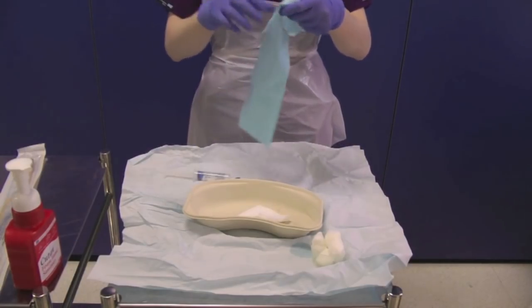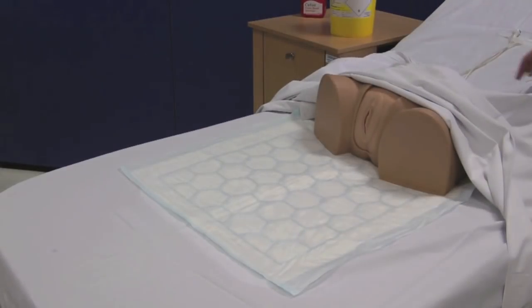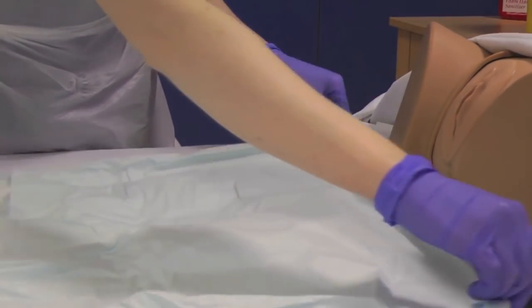Open out the sterile drape. Ask your assistant to expose the patient. Note the presence of the inco pad to prevent soiling of the bed sheets. If the patient is able to, ask them to assume the lithotomy position. Take the sterile field from the catheter pack and place under the patient.